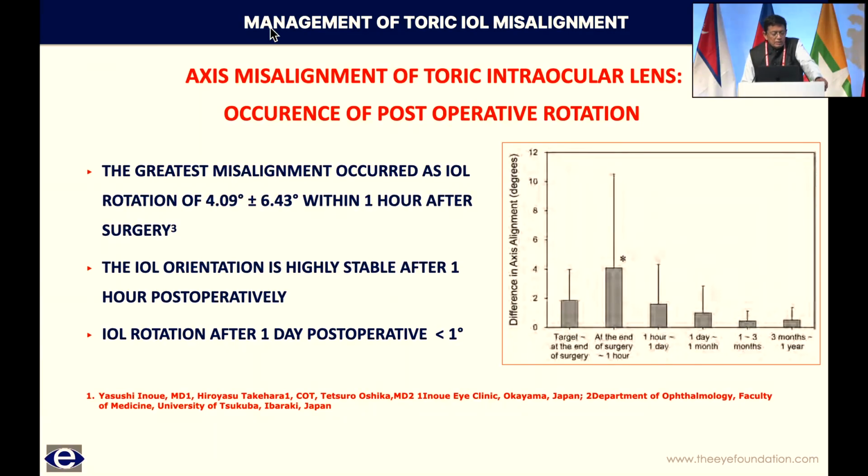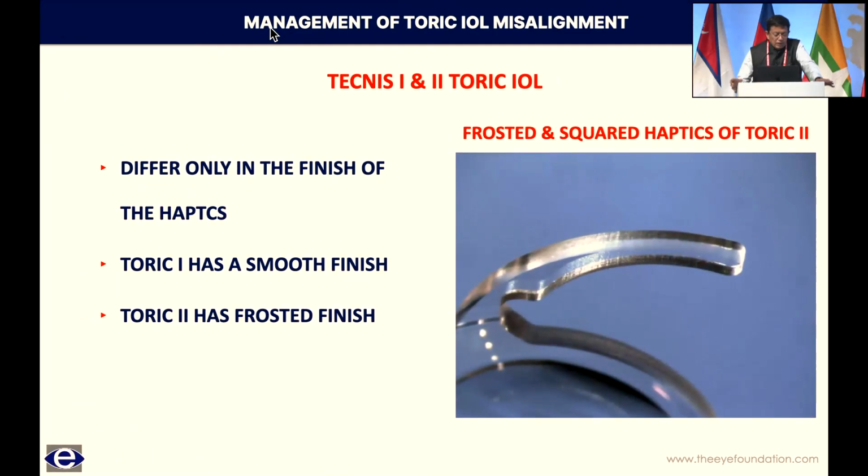This is one of the reasons that we keep our patients patched immediately after toric IOL surgery, even if they're done under topical anesthesia. We patch for about an hour, keep them in the ward, and then see them after a couple of hours and then send them home. We have not done a scientific study, but we feel that this might be one factor to lessen the chance of misalignment.